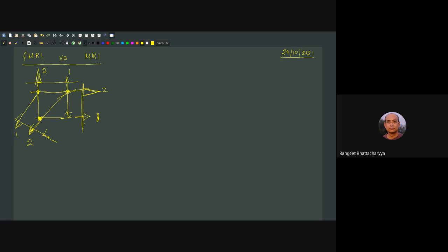Because if you have a pocket of water or some solution where hydrogens are present, that will definitely give you a spectrum. So if a particular line is missing, meaning this intersection, for example, has only 2 lines, then there cannot be anything there. It's empty. So to identify n number of points, typically you need n spectra, almost always. In this case it's just 3, but in reality, it could be a more complex structure. So this was discussed earlier.